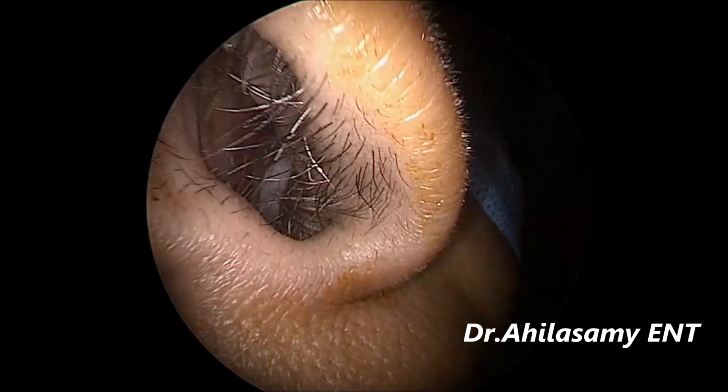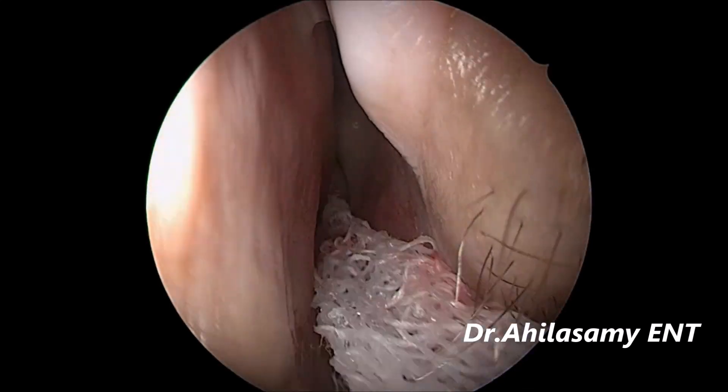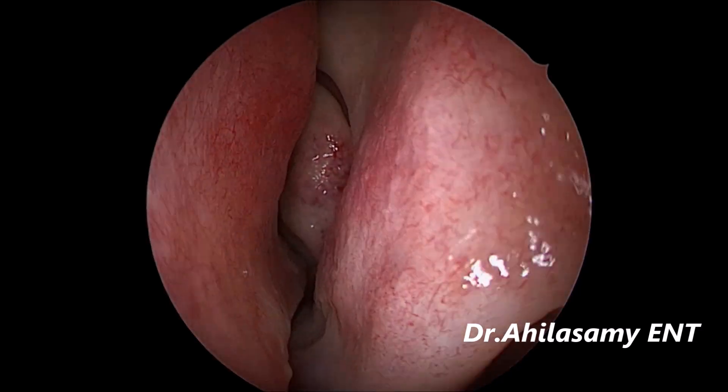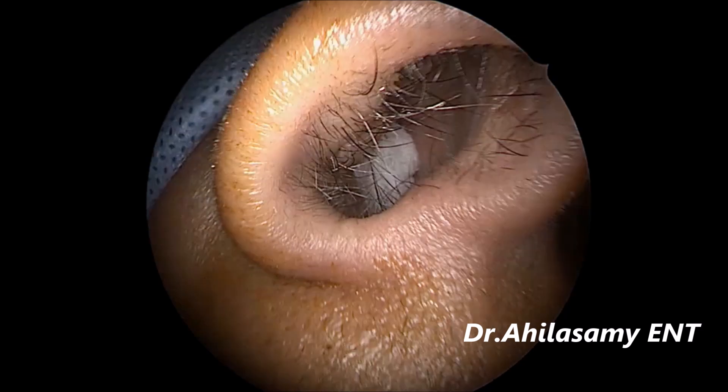I am taking the patient under local anesthesia. Already the nose is packed by my assistant doctor with 4% lignocaine and adrenaline in the ratio of 1:1 on roller gauze.